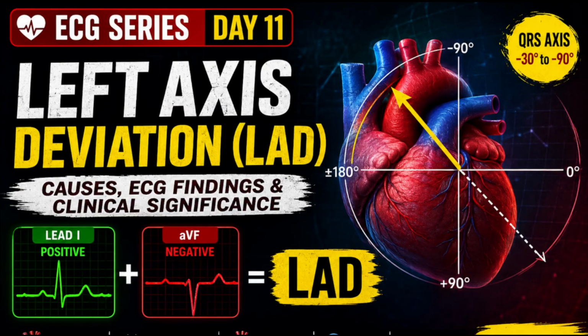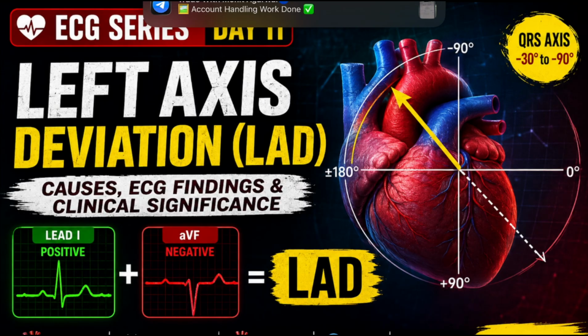By the end of this lecture, you will be able to identify LAD, left axis deviation, in just a few seconds and understand its common causes. Okay, so without wasting time, let's begin.